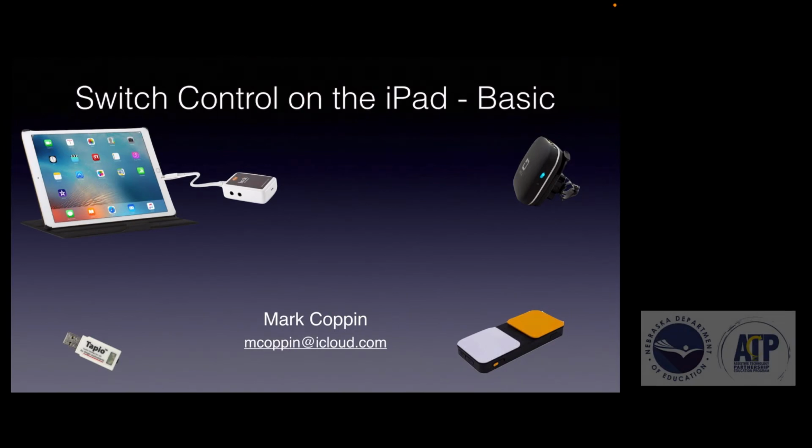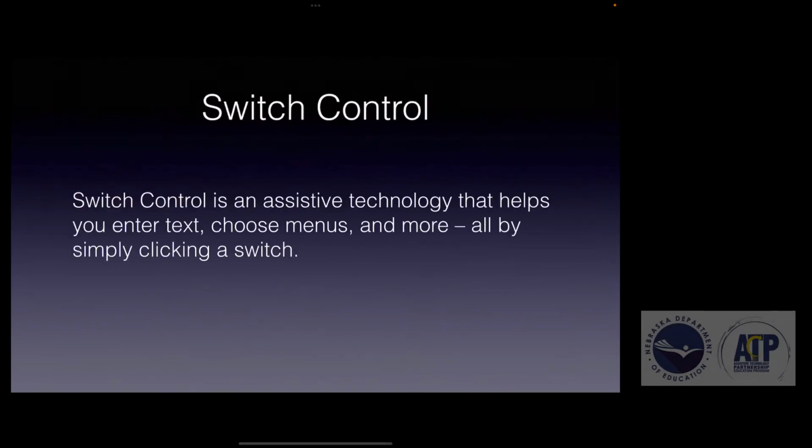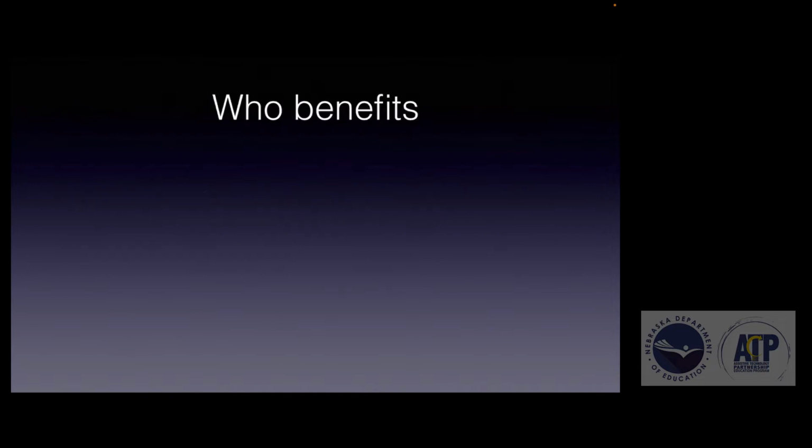Switch control on the iPad basics. So switch control is an assistive technology that helps you enter in text, choose menus, and more, all by simply clicking on a switch. So who benefits from switch control?